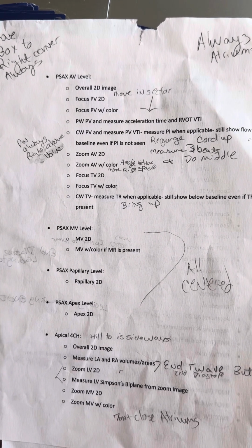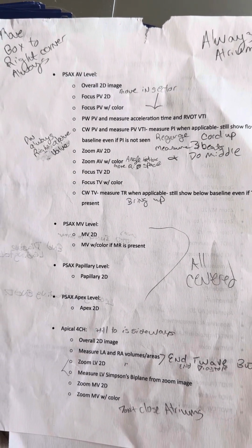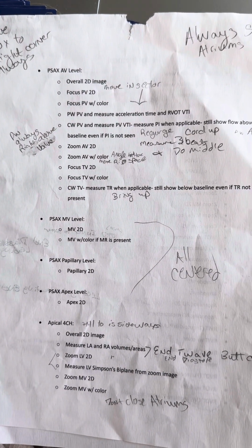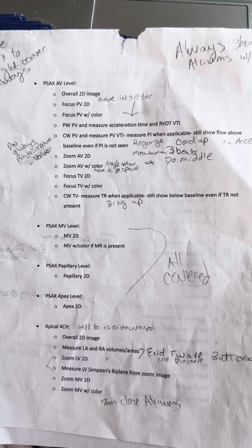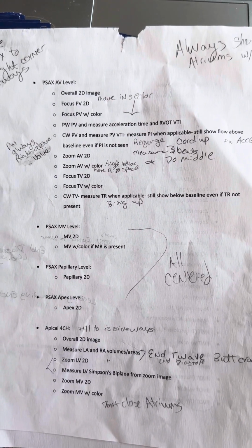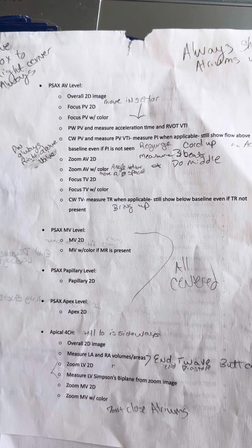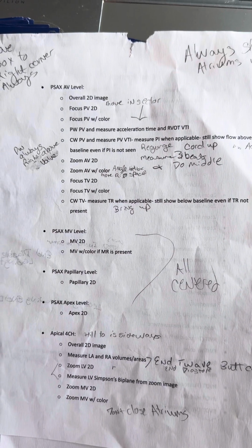Following will be your tricuspid valve. Focus it, put color on it, put continuous wave through it, bring baseline up so you can see below baseline.